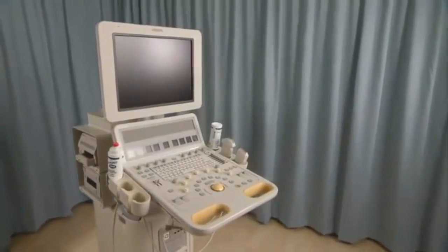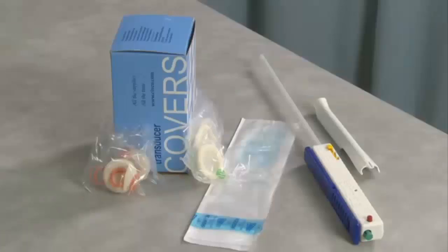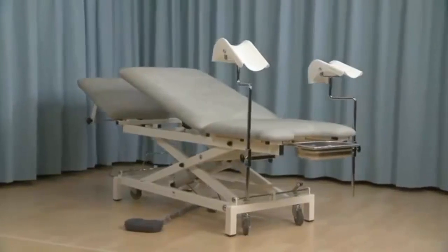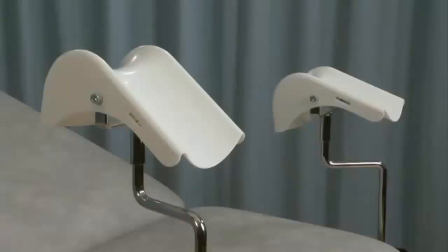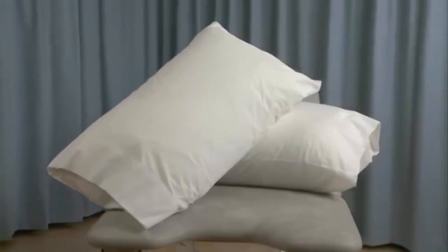Standard floor model ultrasound machine. A selection of transabdominal and endovaginal transducers with covers and biopsy attachment as needed. A powered adjustable examination table with stirrups. Positioning aids such as pillows or sponges.